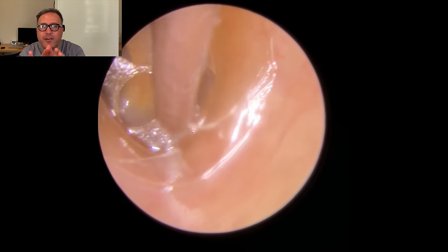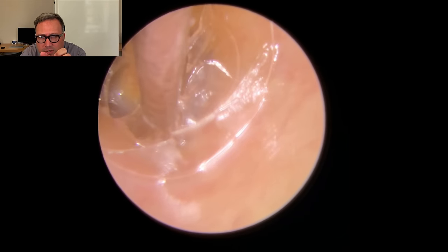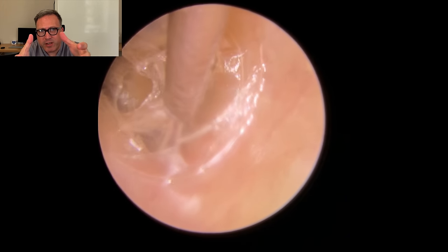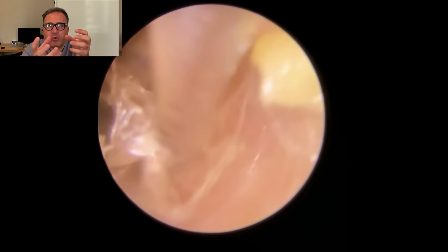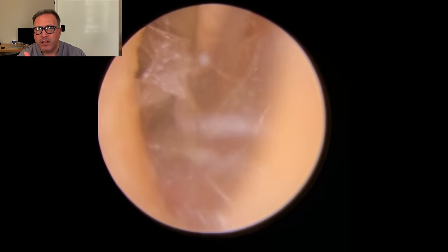So what we're going to do now is we're just going to get a grip on this bottom section here. Hold tight, really hold the suction there. Look how this peels away now as we draw it down the canal. It's like cling film we have here in the UK, like a really thin, transparent layer, look, coming away. It's peeling all the way down the canal.